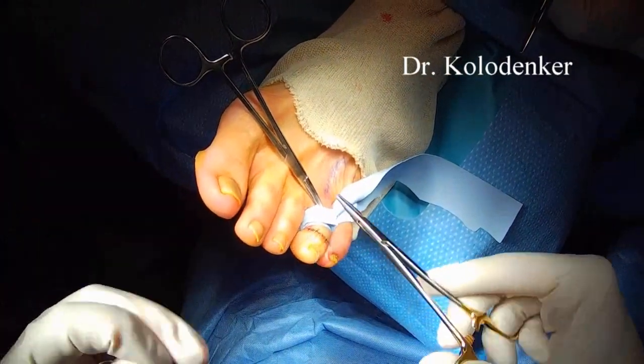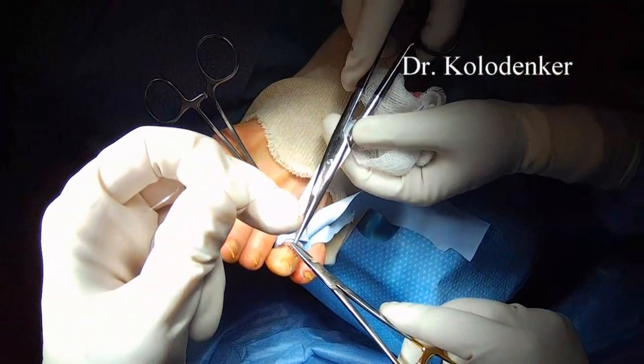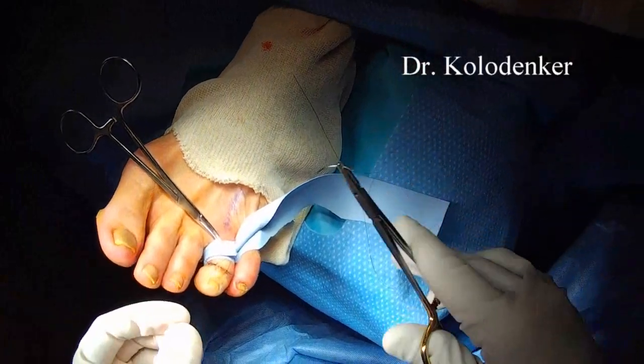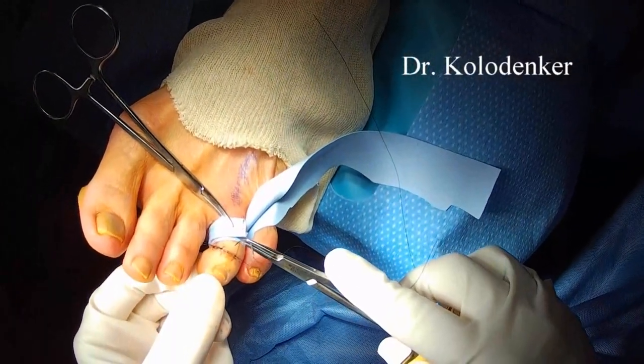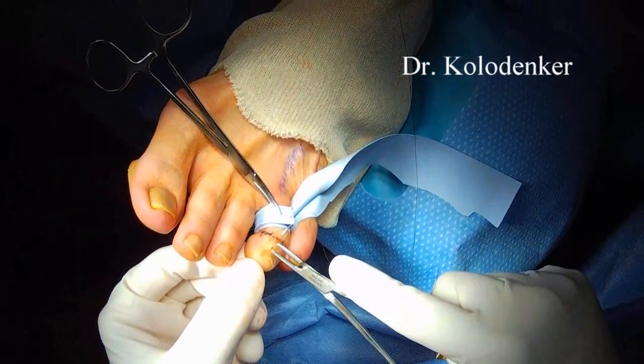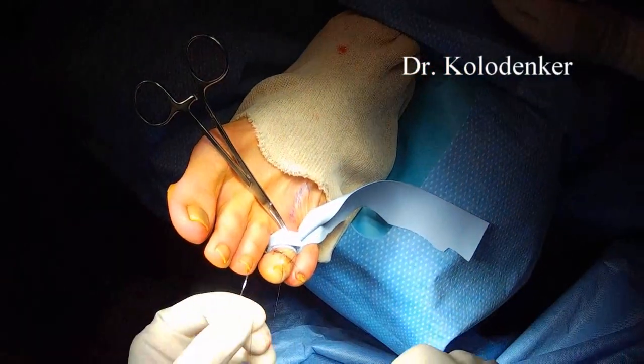A compression bandage placed on the toe will help minimize swelling. I typically use a self-adhesive elastic bandage, something like a Coban, with a non-stick adaptic or Xeroform underneath — and that's usually enough for bandaging.